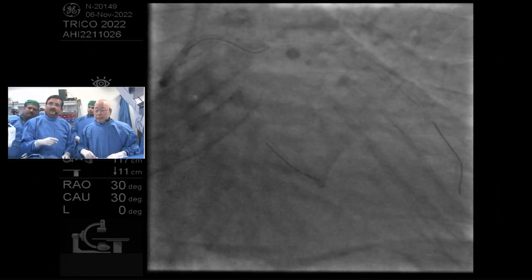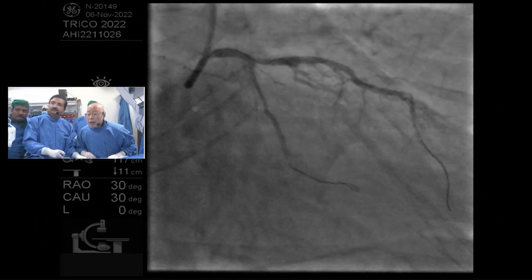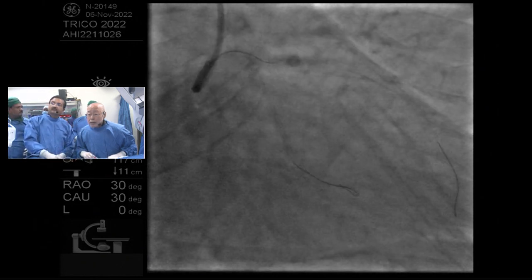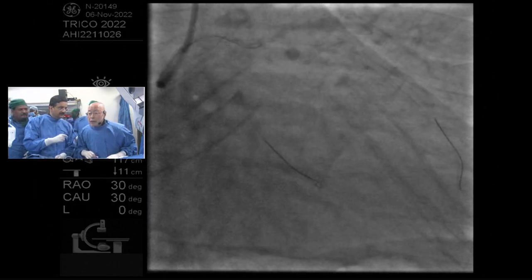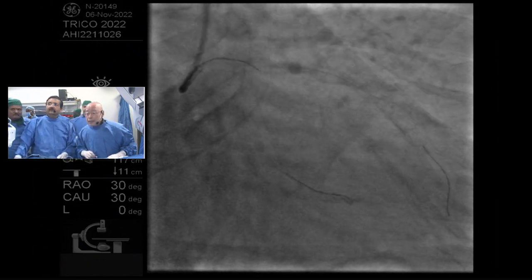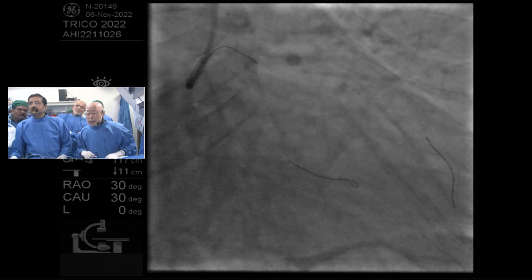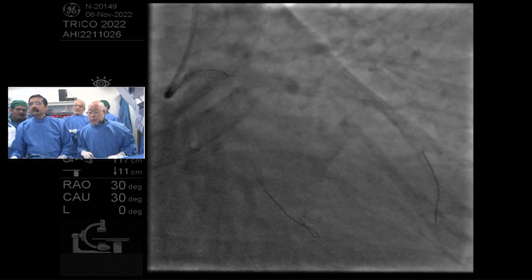Yes. And at the same time, as I told you, some of the interventionists who use OCT still try to focus on the lumen profile, right? Yeah. We have to think about the whole image at the same time. So the longitudinal image with the short axis image gives us lots of information about the morphology. Absolutely. And we can make a decision how to treat.